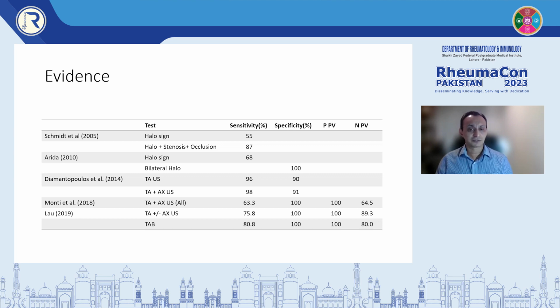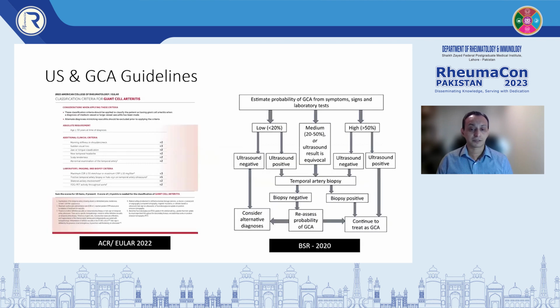The evidence is so strong about ultrasound that guidelines around the world, including BSR, included the ultrasound as a part of GCA pathway in their guidelines.